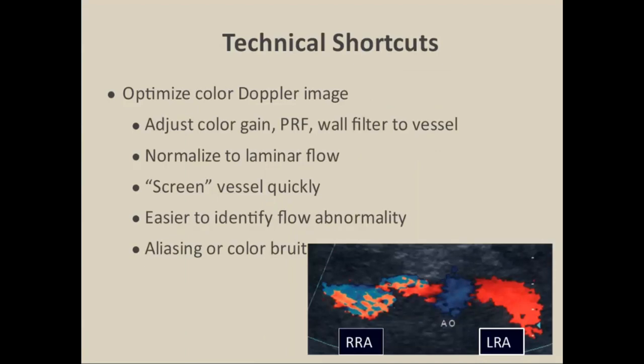One important shortcut to performing a complete renal duplex examination efficiently is by optimizing the color Doppler. In this example, we see a color change — aliasing at the site of stenosis in the proximal renal artery. That draws your attention quickly so you know where to place the sample volume to get the highest peak systolic velocity to characterize the lesion. We adjust the color gain, pulse repetition frequency, and wall filter normalized to laminar flow. This lets us screen the vessel quickly and identify flow abnormalities — aliasing for high velocities, and bruit artifact for high-velocity vascular disturbance.